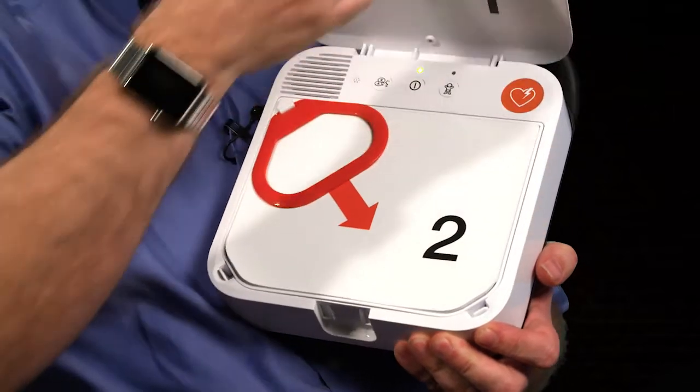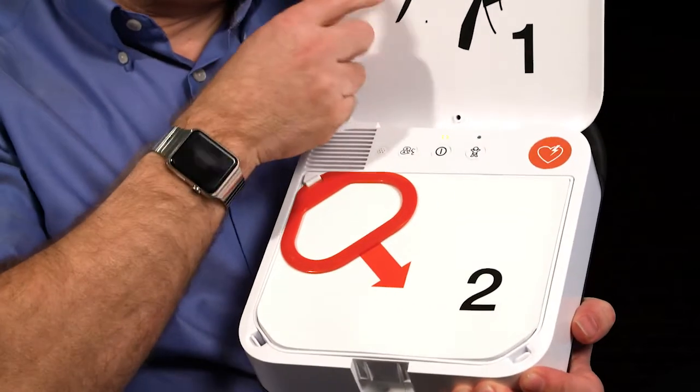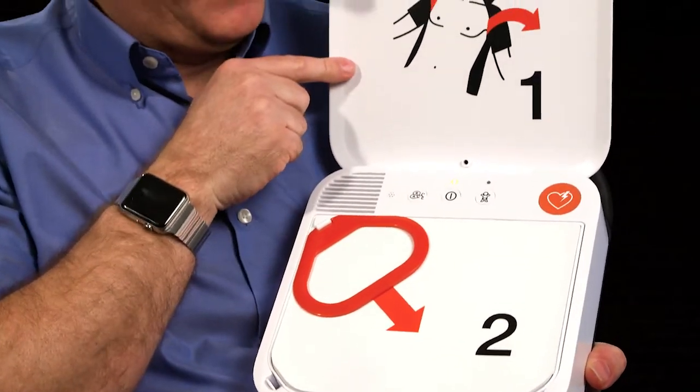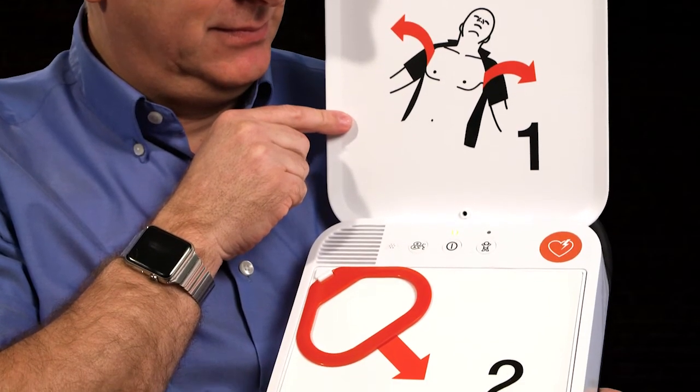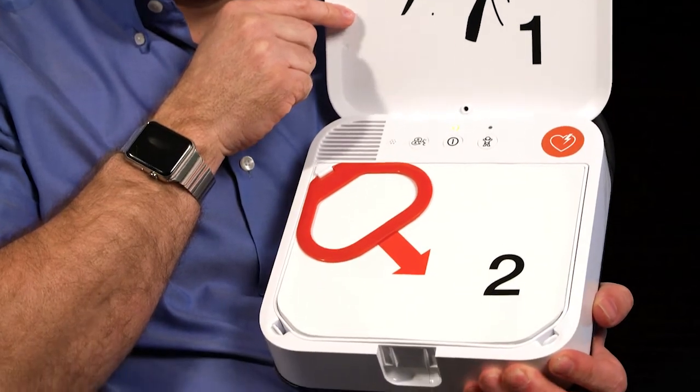When using the CR2, it's easy to peel the pads from the base for faster placement. It has clear voice commands and a metronome, and CPR coaching sets for effective pace and audible guides for users.